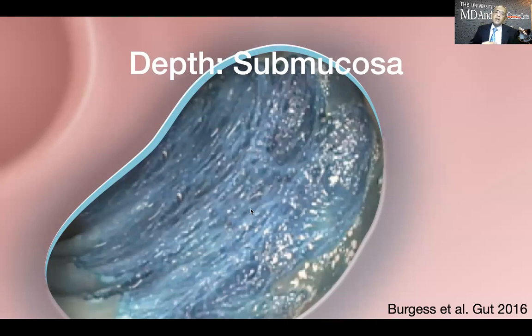And when you cut and you see blue like this, the lesion is unlikely to develop a perforation unless you've used a lot of duration of cut and the energy has gone deep. But if you cut fast with a 313 and your snare is tight, you rarely will end up with delayed perforation. So this is submucosa.